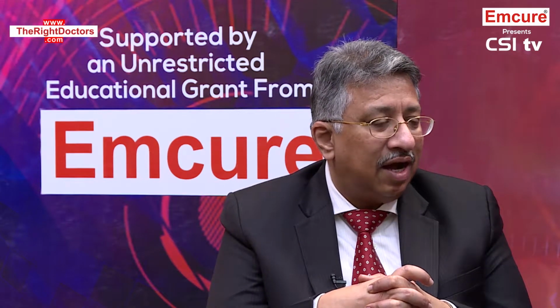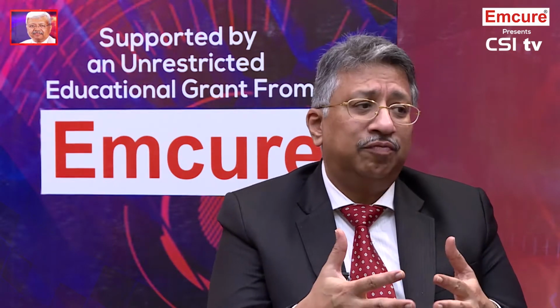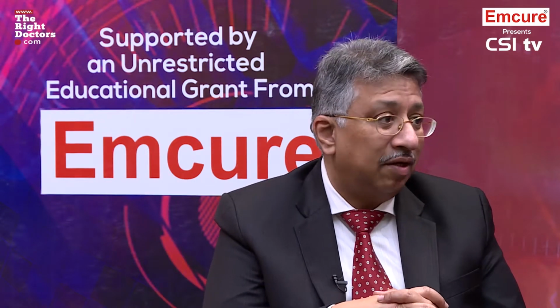So I think the answer would be somewhere in between, because in my own experience, in our own practice, we have found that most of our left mains' actual size is more than 15 to 18 square millimeters. So I think we must try and attain at least 6 millimeter square or more in the Indian population. Our left mains are not, as we believe, smaller than the Western population. Of course, that's my anecdotal experience, but we don't have data on that.